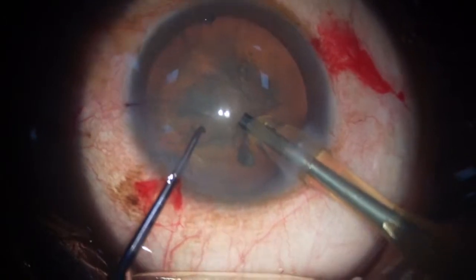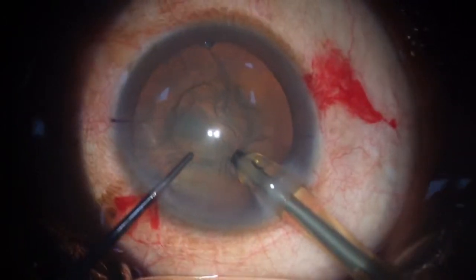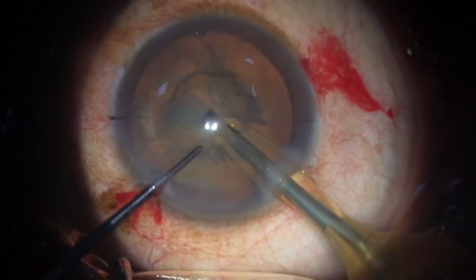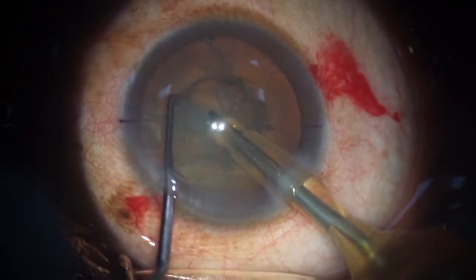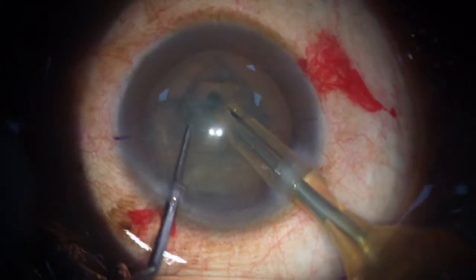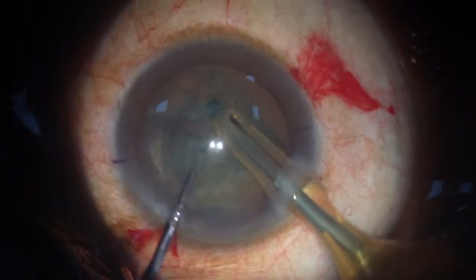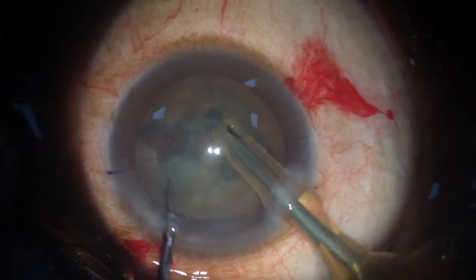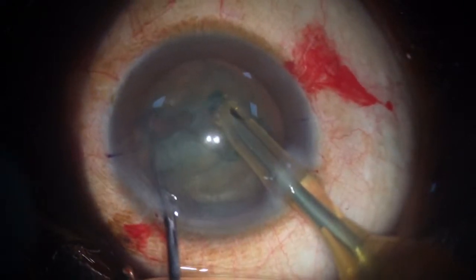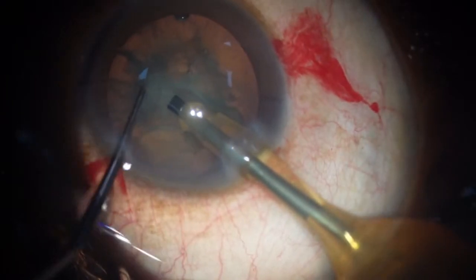Okay, so here goes. This is not a hard cataract really, so I'm hoping that I'll be able to crack it and chop it. It's fairly soft. She's a young lady, 49-year-old. So when it's a very soft cataract, it makes sense to chop right in the middle. If you try to chop in the periphery, it'll just cut through. So when I'm doing a softish cataract, I like to initiate my central chops because that's where the nucleus is a little firm.